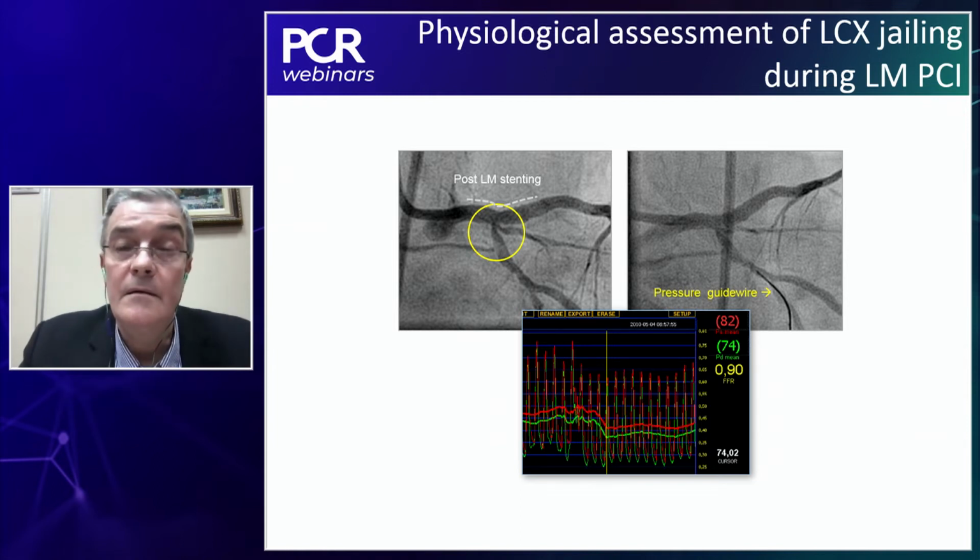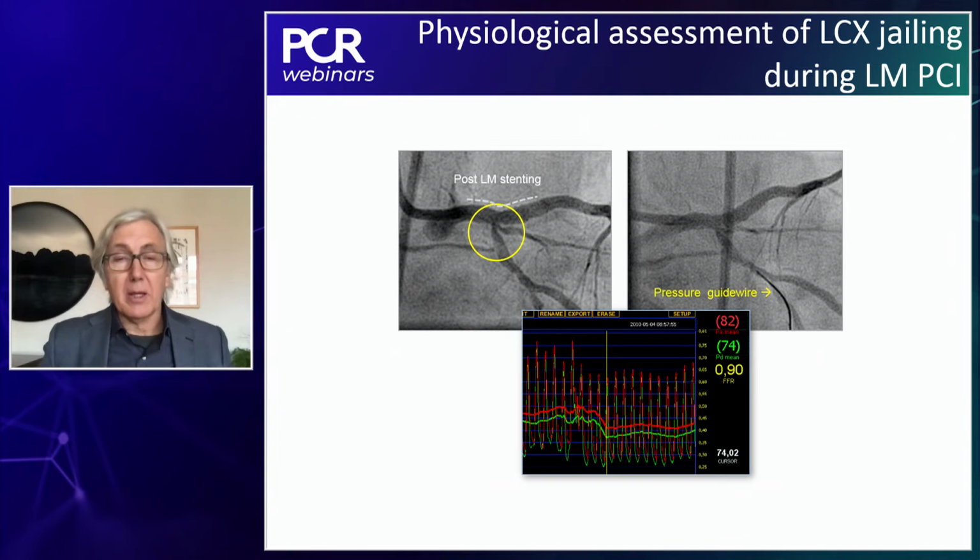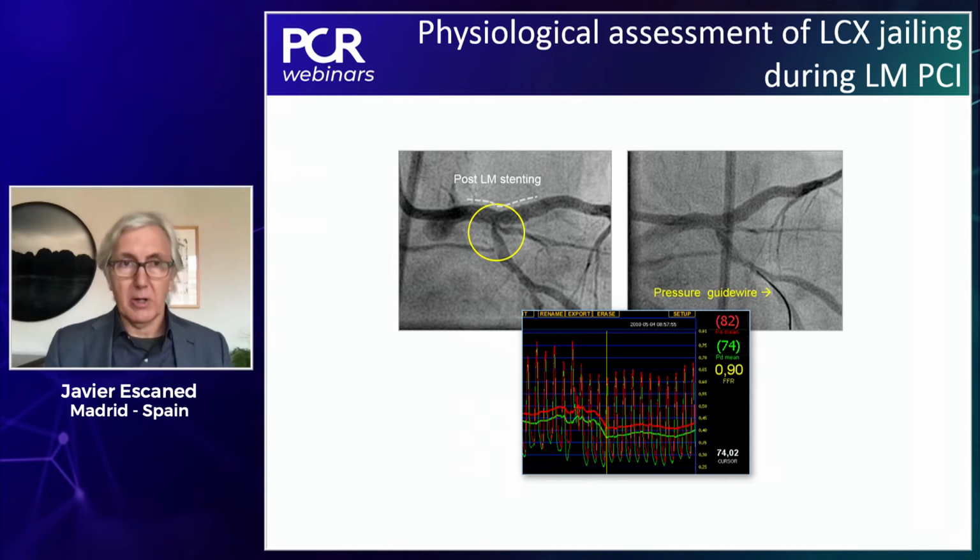Goran, I think an important message for the colleagues regarding this is that sometimes we jump from a scenario where decisions on left main revascularization and guidance are purely based on angiography, which is a very suboptimal tool, and then we go into very exquisite and hypothetical scenarios. I think that these techniques give you enormous information, but they don't take away your responsibility as a physician of deciding for the specific patient what you have to do. This is something very important.